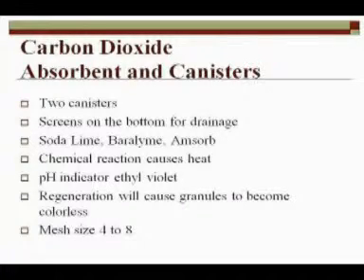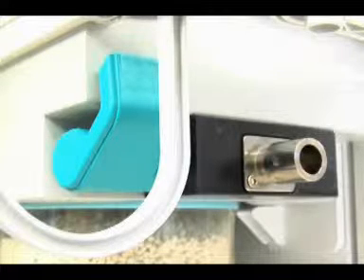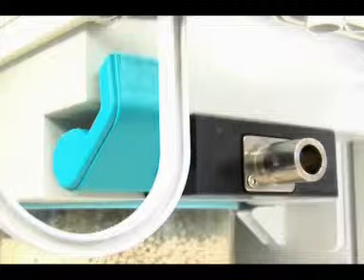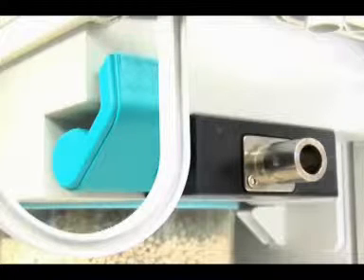The common gas outlet supplies gas to the breathing circuit. It is sometimes called the fresh gas outlet because it adds new gas at a set and known composition to the circle system. There is an auxiliary common gas outlet on some machines. The auxiliary common gas outlet is used for the low-pressure circuit leak test.